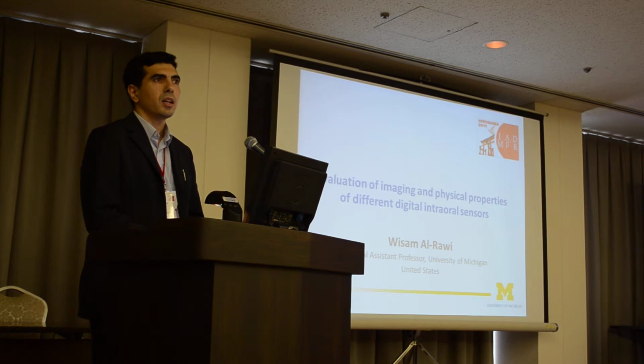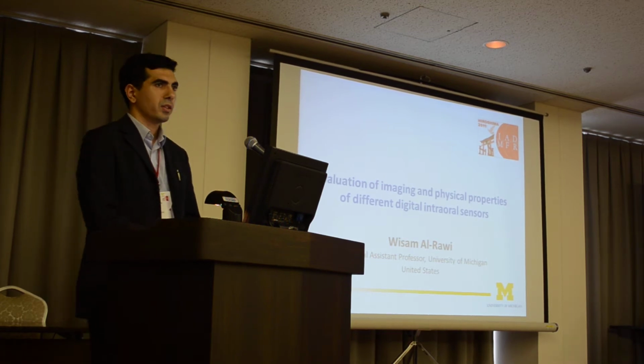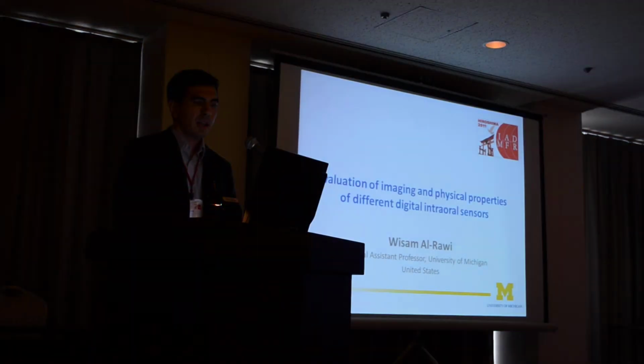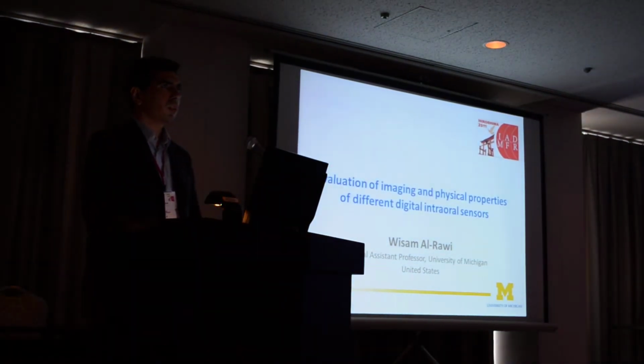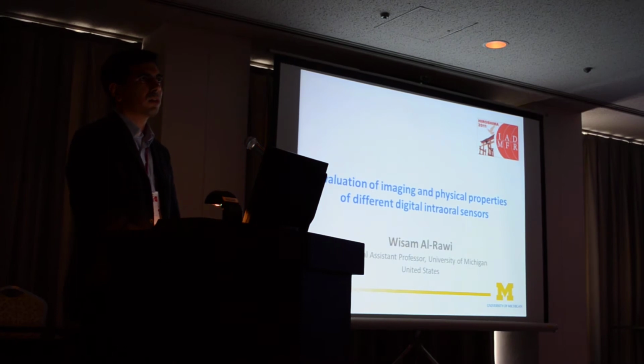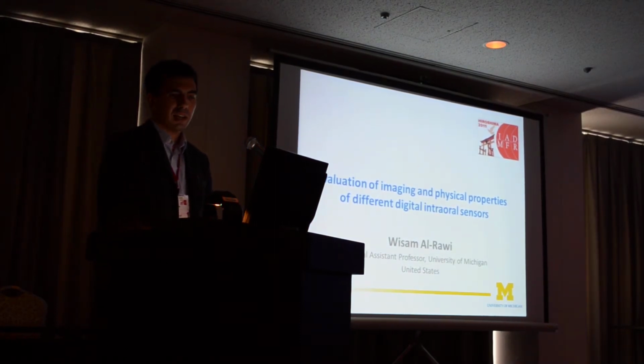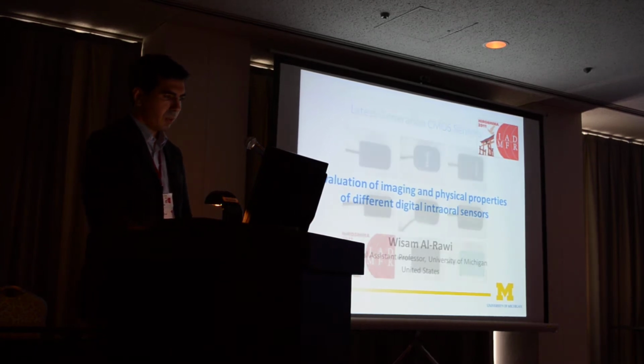It's a pleasure to be here. I was part of the digital subcommittee formed at Case Western Reserve to evaluate the implementation of digital radiography at the school. As you may know, going with digital radiography, especially intraoral sensors, saves you time, gives you better image quality, and has less radiation dose to the patient.